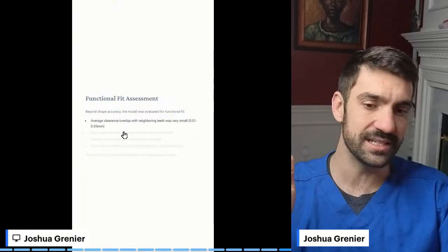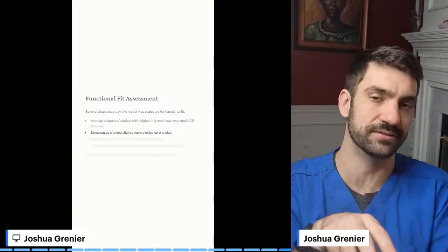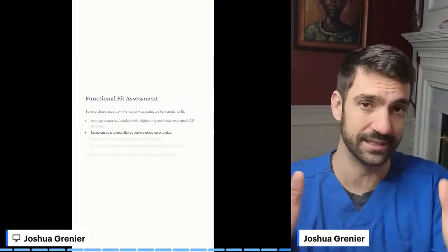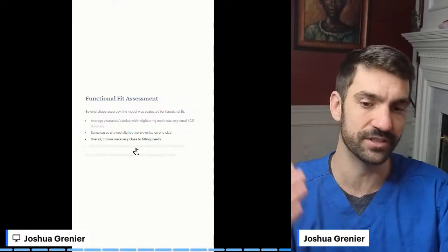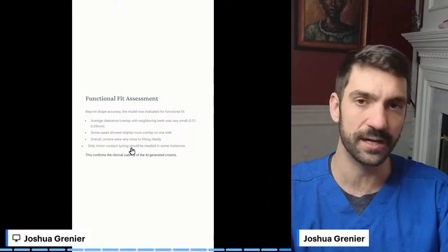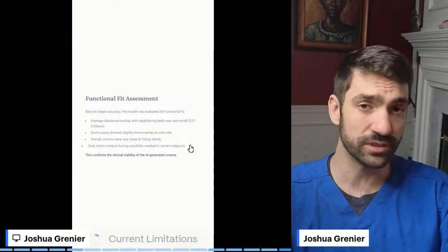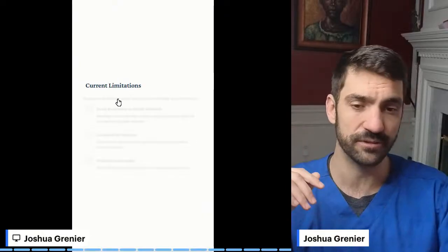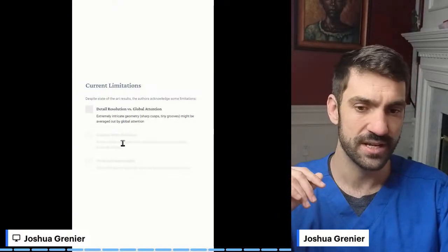And the interesting thing is, these didn't necessarily use the more traditional methods, where you're using a subtractive technique, where you maybe build up the top of the crown generatively and then subtract it onto a virtual digital die. This works a little differently. This creates the whole thing, and it works fairly well. They claimed they had fairly small overlap, which is really very impressive, given the amount of data they were able to put in, and the limited customization they really did on these models.